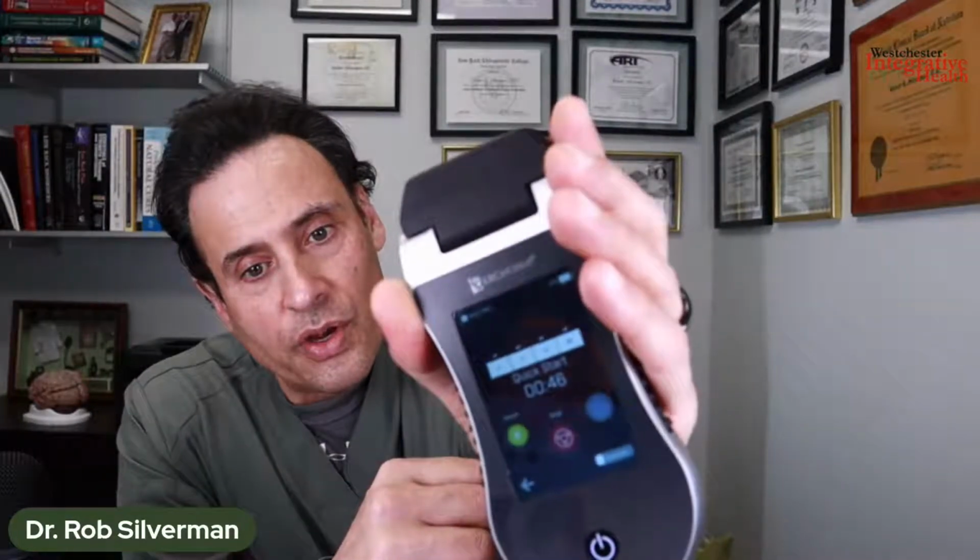Now, here's where the sweet spot really is. And this is, using it this week, getting tremendous clinical outcomes. There's something here, and I hope you can see it. Let me tap it so it gets a little lighter. There's called the standard. That's the standard right now. And in here, hopefully you can see 2, 4, 14, and 28. So that's what it looks like. Because I'm going to do something. I'm going to stop it, and I'm going to restart it so I have 2 minutes. So the standard means that it's beeping on a different frequency. Now I'm going to go to something called, if I can get my finger on it, the linear. So hopefully you can see that it says linear.